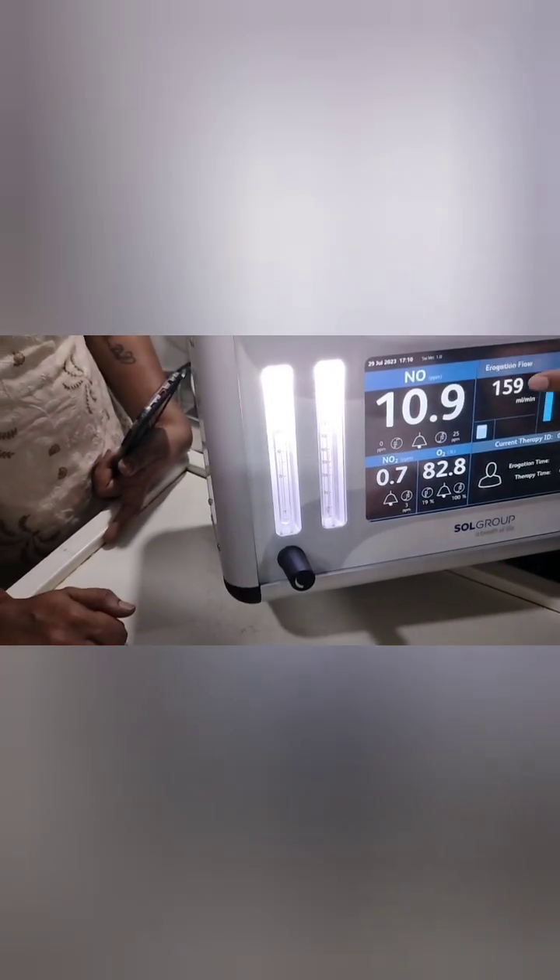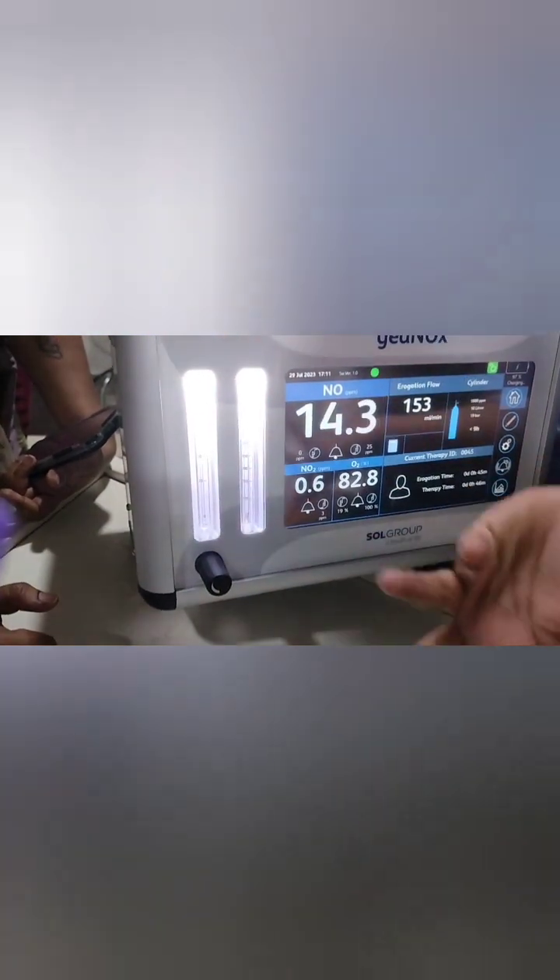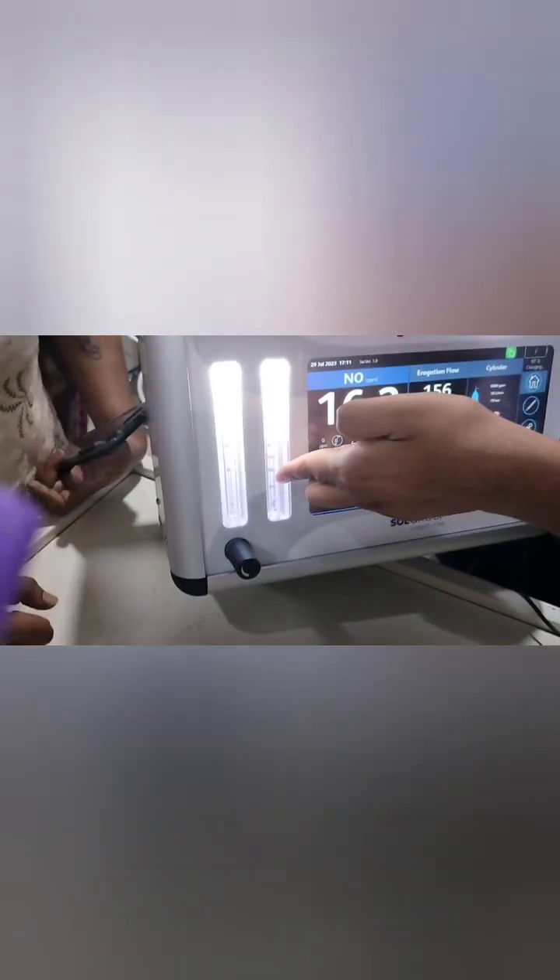The ppm is now increasing and will go up to 20 ppm over a period of time — you have to be patient. It will slowly increase and slowly decrease. Without the calculator you would not know how much to set, but with it you know the target flow. You set it once and the value will rise accordingly.